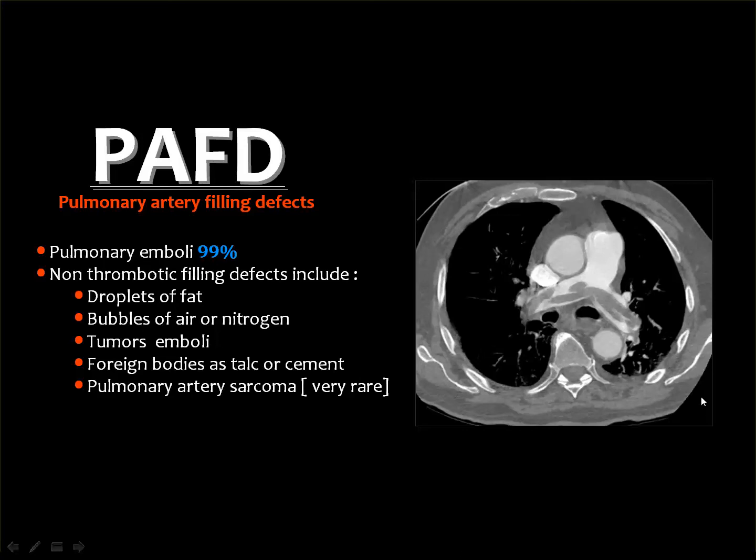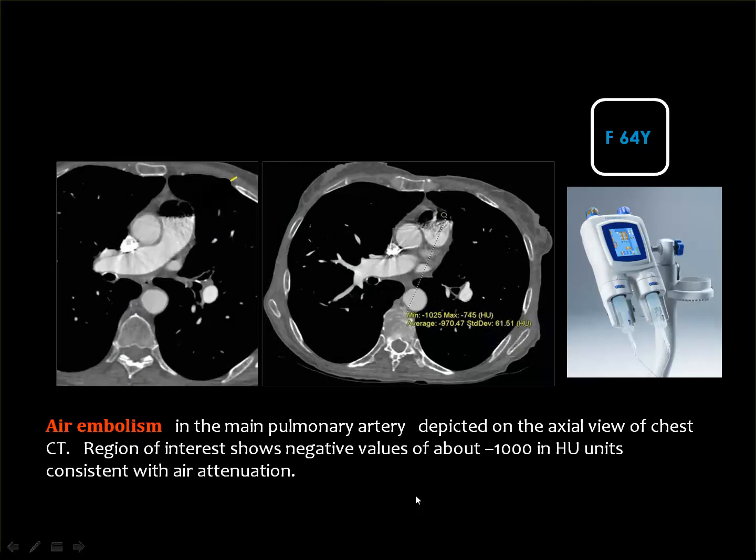Other filling defects include droplets of fat in cases of fat embolism, bubbles of air, tumor emboli, foreign bodies, and pulmonary artery sarcoma, which is very rare.